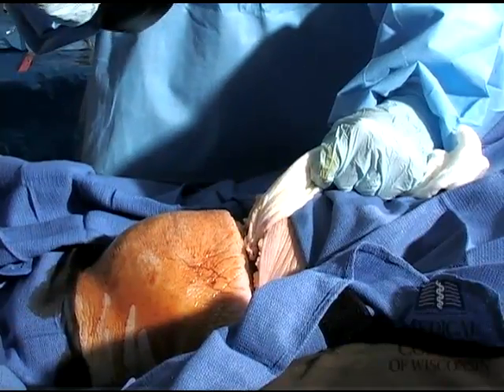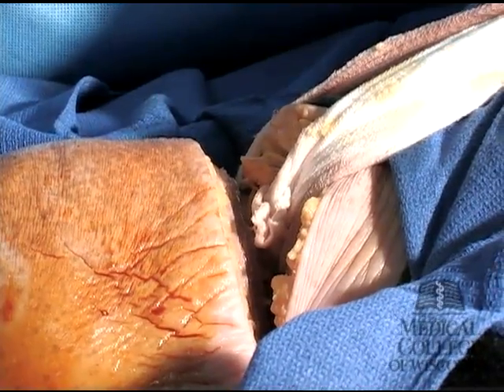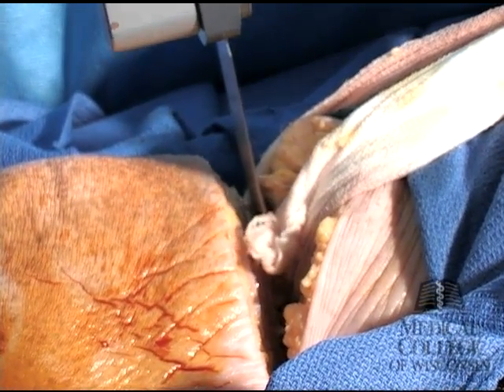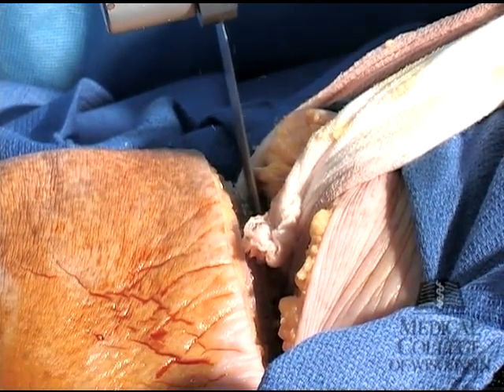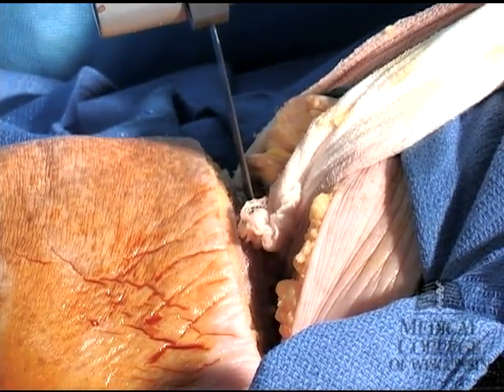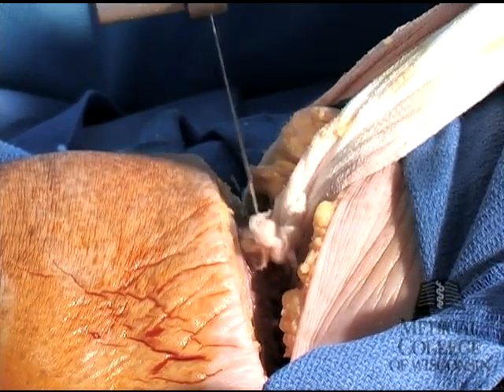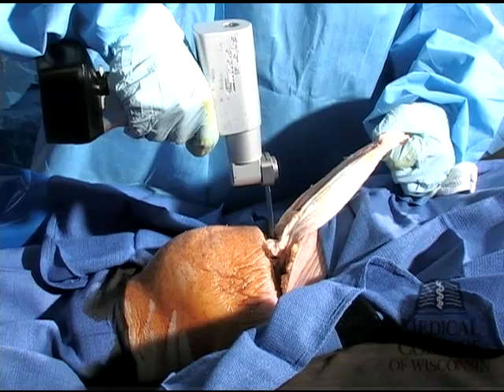Next, the saw is used. Remove the safety on the saw. Check function of the saw by turning the saw on. Place the saw directly over the bone to be transected and cut perpendicular through the bone. You will feel release of the bone, which will indicate when to stop sawing.